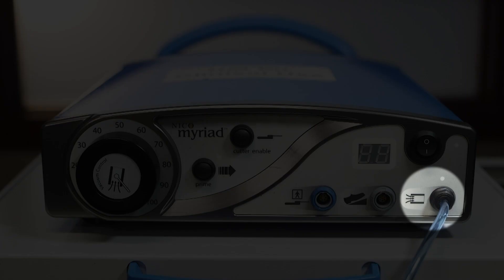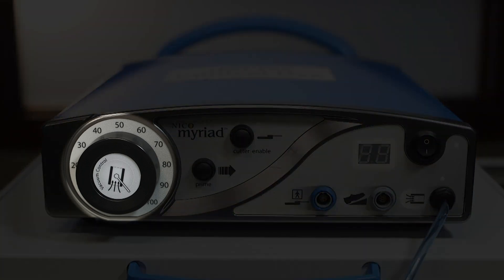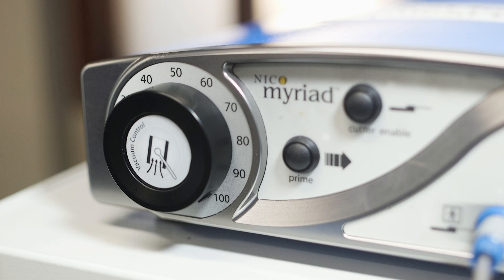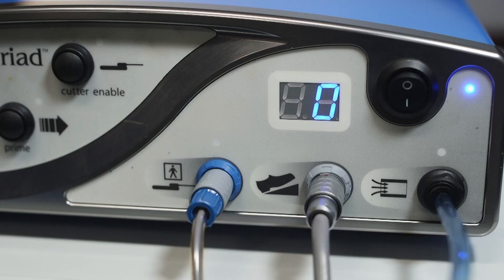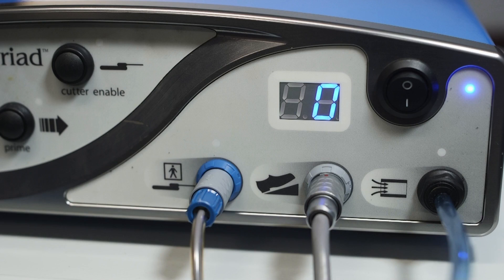This is the attachment site for the aspiration hose to the console. Using this dial or governor, the user can increase or decrease the maximum aspiration level achieved at full depression of the foot pedal. For open cases, the surgeon typically sets the governor to 100. For ventriculoscope cases, the surgeon typically sets the governor to 60 or less. A digital display indicates the aspiration level in nondescript units, ranging from 0 to 25.